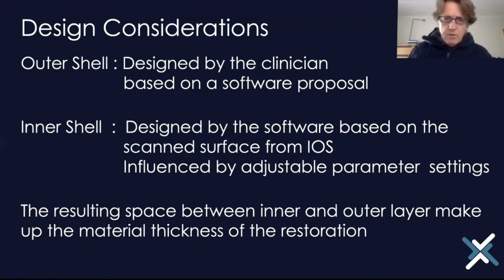The outer shell, that's your part to design, and that's created based on a proposal that the software gives you, and you can go and adjust. No matter, we're not talking about specific softwares here. We're talking about everybody, all the companies. So the crown can be adjusted, whether it's you, whether it's your technician, doesn't really matter. Anybody that works on it can change that. But the inner surface is non-changeable.